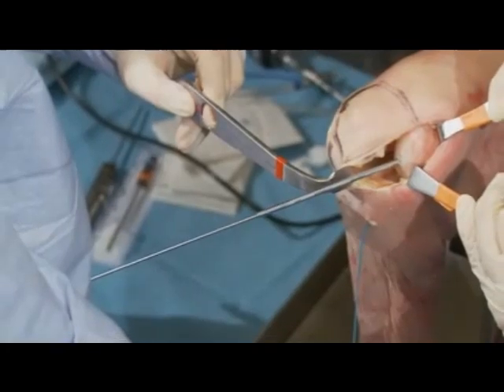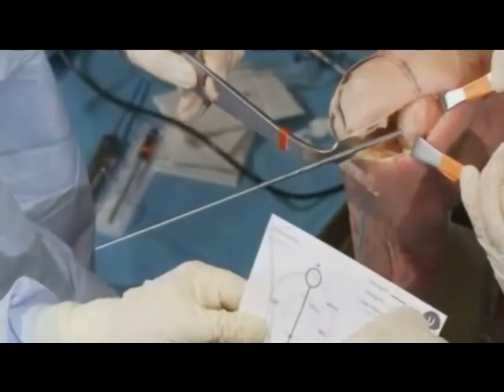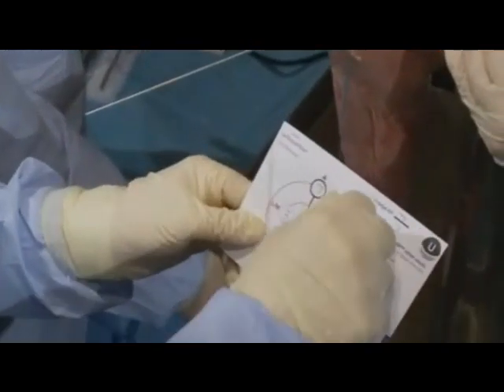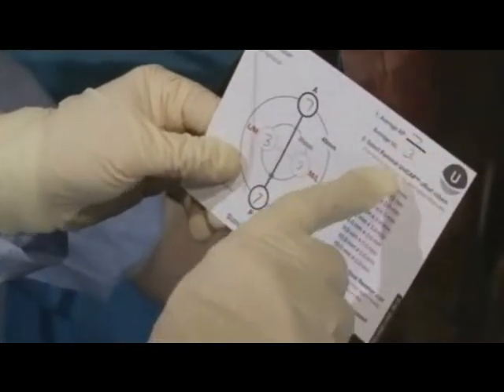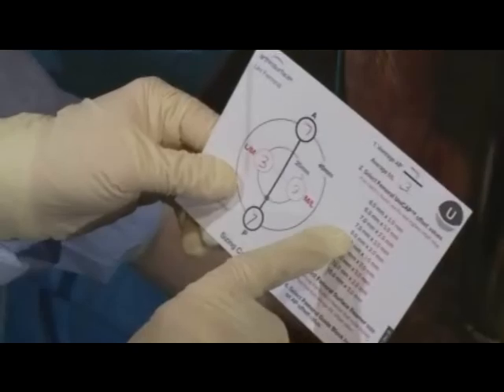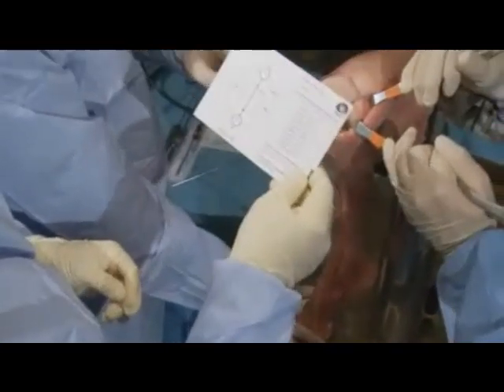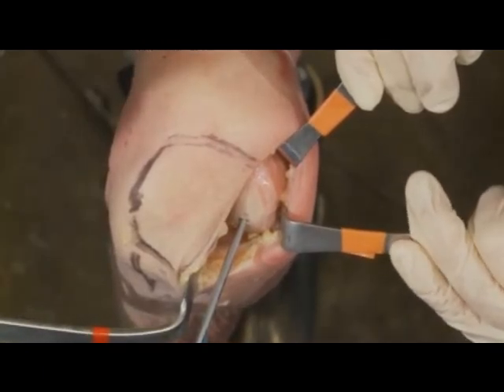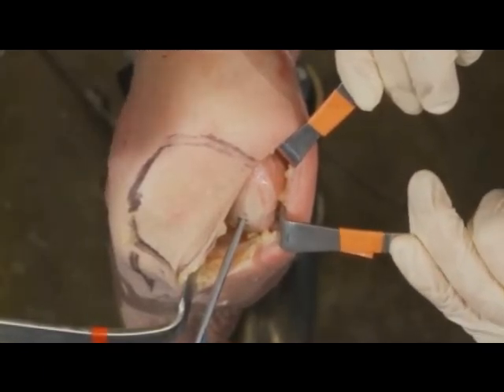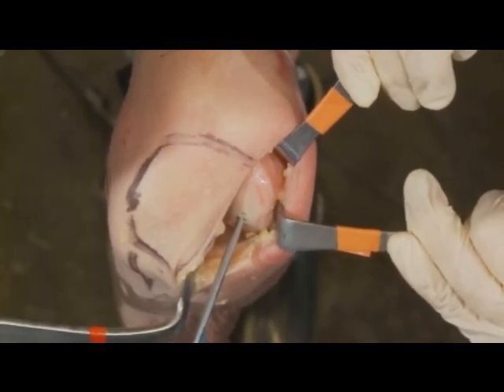So what we've measured here, and you have a card, and you have the number of implants. We have 10 different implants and a card, and it tells you once you have all your numbers in place that we're going to need a 7x3 implant, and that's how you base the rest of your reamers off of it. So you can see there's the card that comes with each set, and there's the setup. So we've got everything in place still, so the next thing we do is we've got to drill our central reamer.